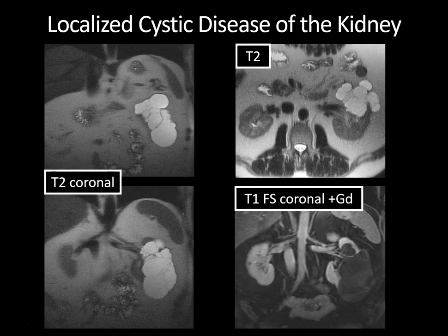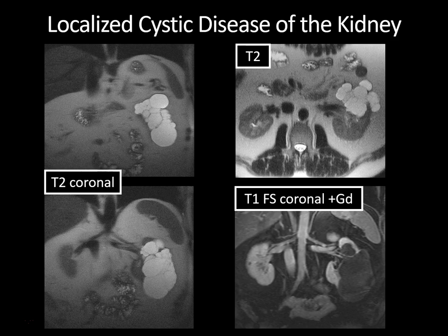This is typical for localized cystic disease of the kidney, which is actually benign. This patient also had an MRI because it's a difficult diagnosis on ultrasound. On the axial T2 image, the mass has a lobulated cystic contour — not well encapsulated or rounded like you'd expect for cystic renal cell carcinoma. The fluid in the spinal canal (CSF) is bright on T2, as is this cystic material. On coronal images, normal parenchyma interdigitates between the cystic areas, and it's lobulated and not encapsulated. On the post-contrast image, there's no enhancement within the mass — only enhancement of adjacent normal renal tissue. This is a benign phenomenon, though it can be confused with cystic renal neoplasm and is often followed up, with partial nephrectomy sometimes performed.